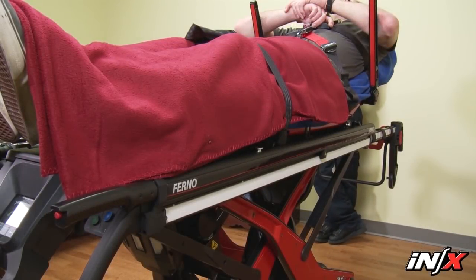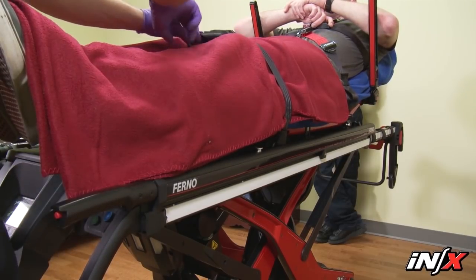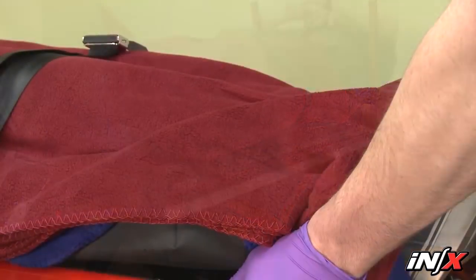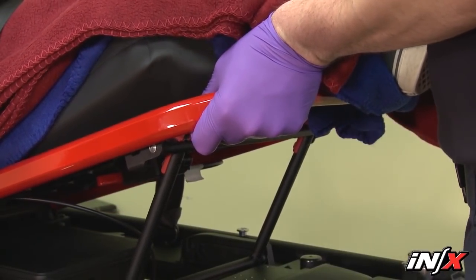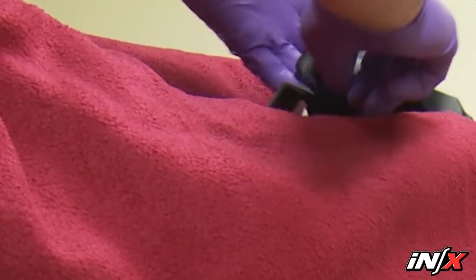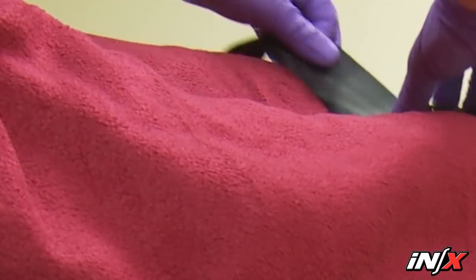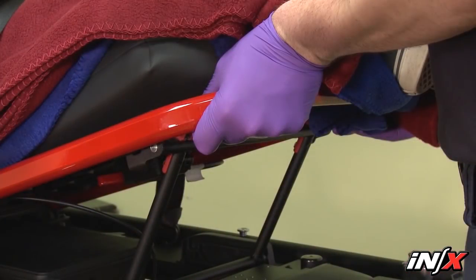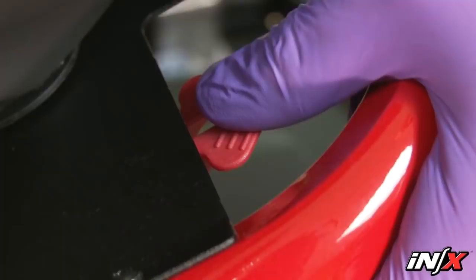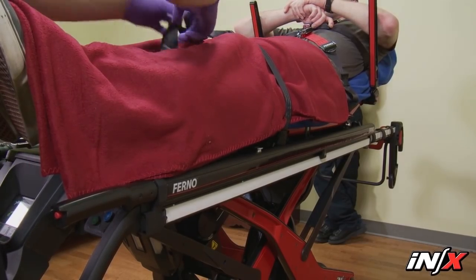Adjust the shock frame only when standing at the control or foot end of the NX. Before adjusting the shock frame, loosen or unfasten the leg restraints. Use an underhand grip to lift the frame until it locks into the raised position, then re-fasten or tighten the leg restraints. To lower the shock frame, loosen or unfasten the leg restraint, support the weight of the shock frame and the patient with both hands, lift slightly, and then press the shock frame levers to disengage the support bars. Lower the frame and adjust or fasten the leg restraints.